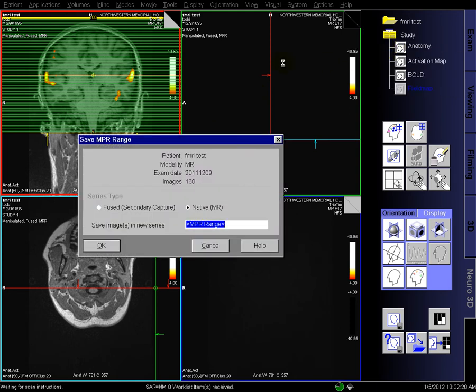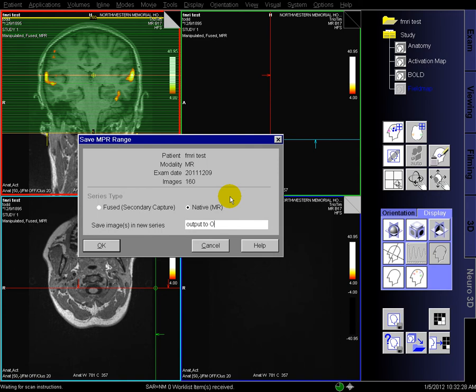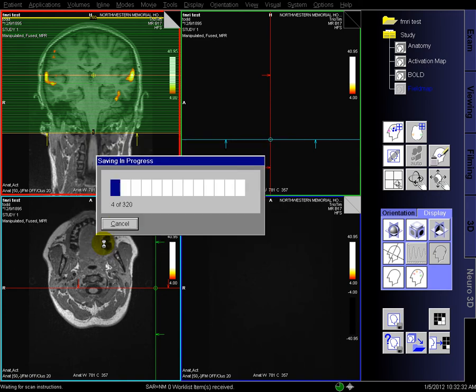Now you have two options for fused or native. We're going to use native which gives you two DICOM data sets, or the fused is just one image output that you can't really use for the OR. So native is where you want to go.